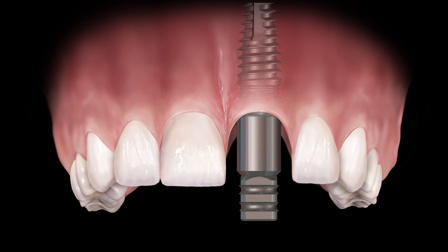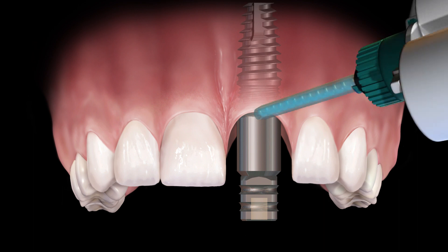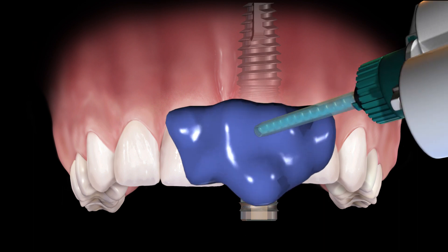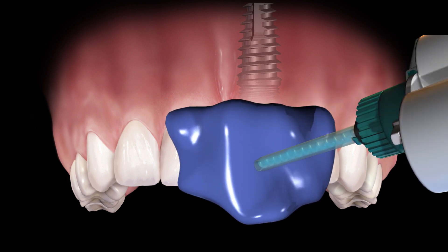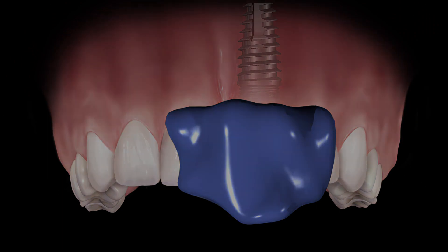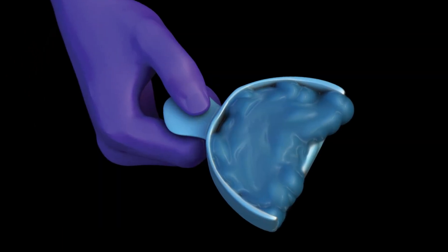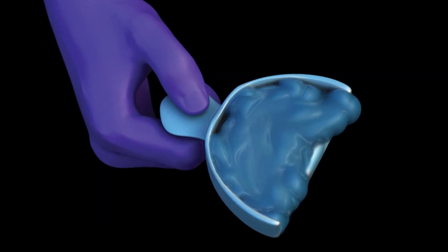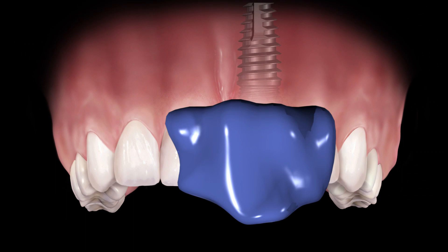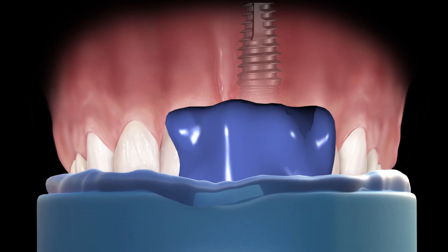Fill the top of the screw head with wax to prevent impression material from flowing into the head of the screw. Inject medium body impression material around the multi-purpose abutment, then inject medium body impression material into an impression tray. Take an impression.